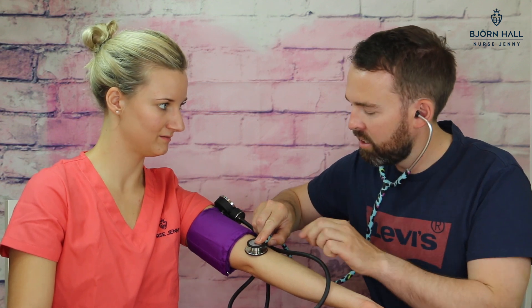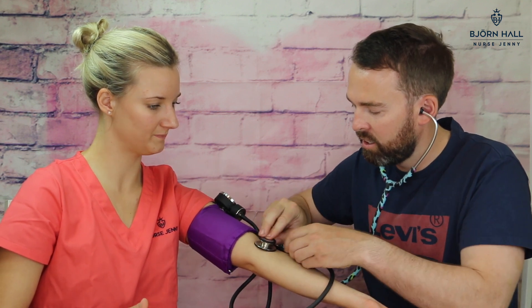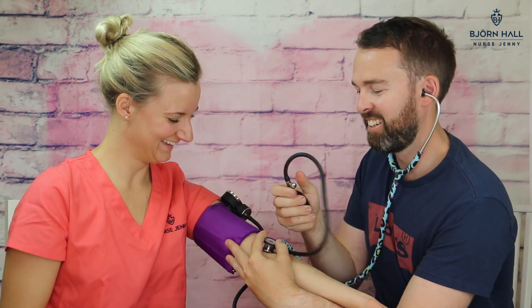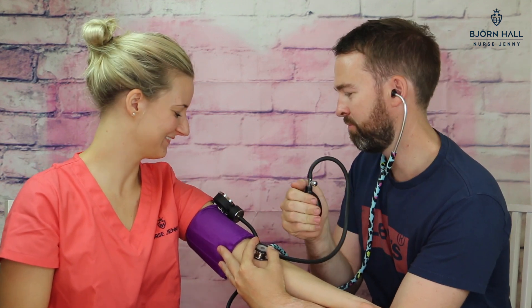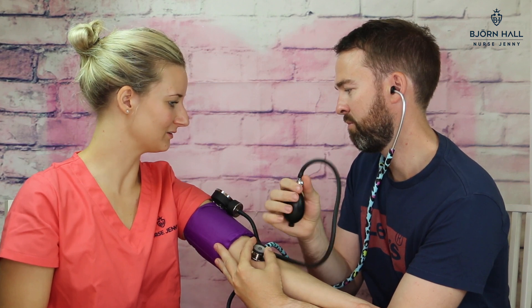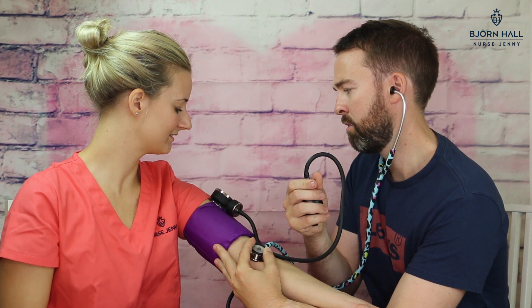You might not hear it, so feel it and put it on top of it. Feel it. Put it on top. Make sure — so you want to hold that with your right. This is very confusing. Okay, so towards me, closed. And I'm going to go to 130. And release slowly. So it's 120.